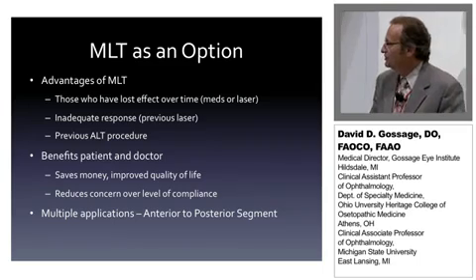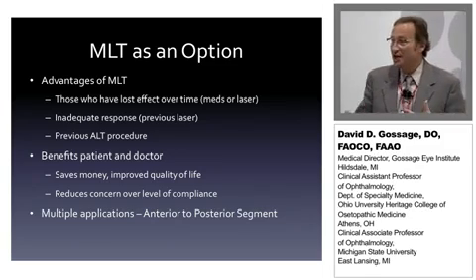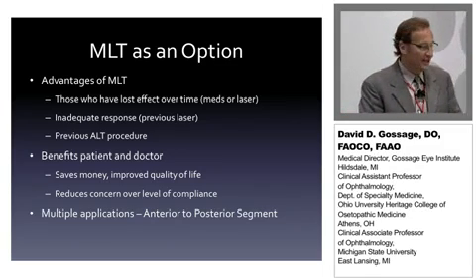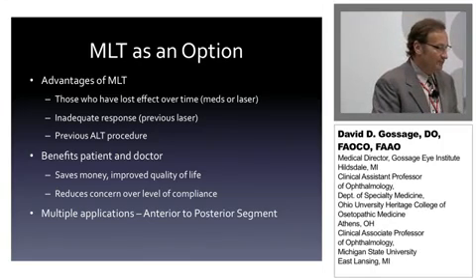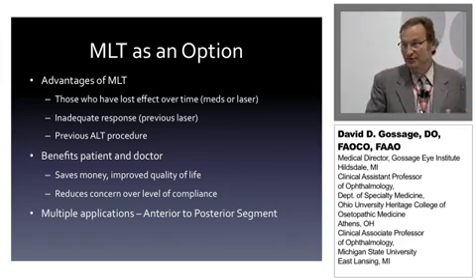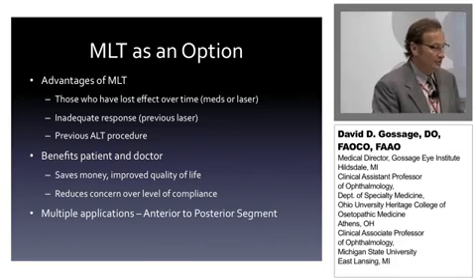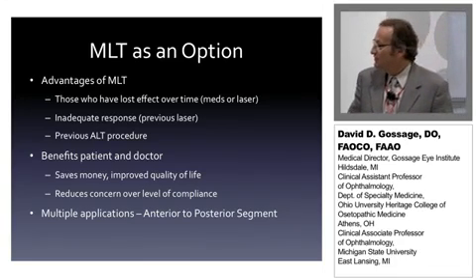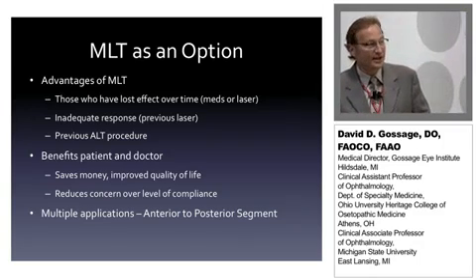The advantage of the MLT is that we can use it in those patients who have lost effect over time, who have been on previous medications or have had previous laser and they're failing therapy. Also, people that have had previous ALT, like we said before, it still works. The benefits to the patient, the doctor, is that it does save money. You don't have to worry about medications. You don't have to worry about the compliance of these patients.